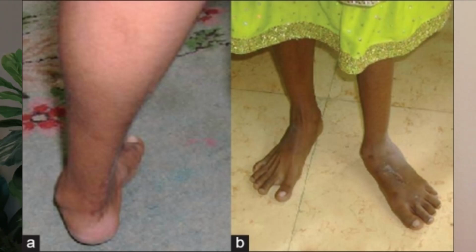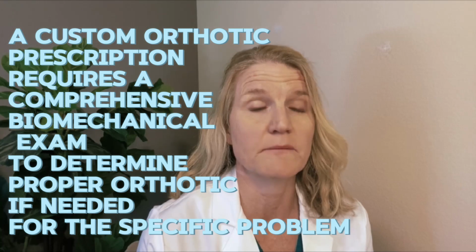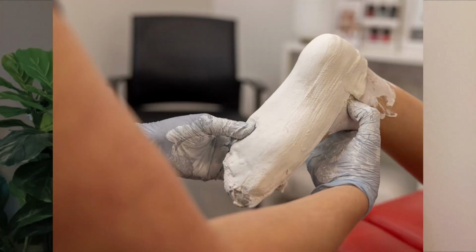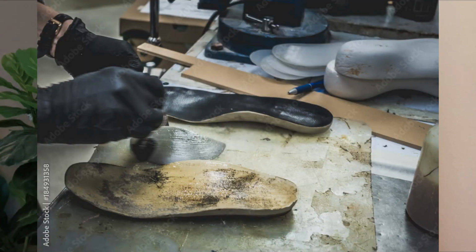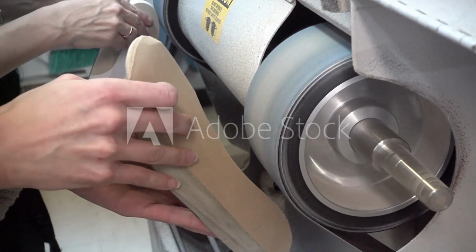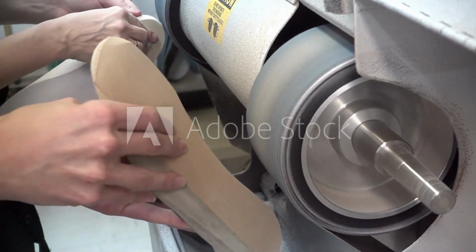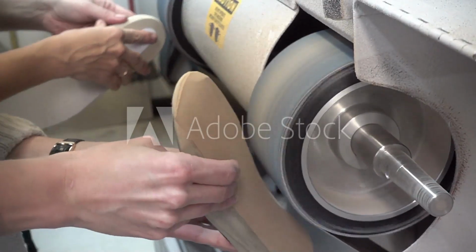So a prescription for custom orthotics requires a knowledgeable podiatrist to assess the abnormal mechanics and foot type that results in the specific problems. A cast or impression digitally is taken of the foot in a neutral position. So that's captured, and the detailed orthotic prescription is written, and the orthotic lab constructs the device. Because of the tedious work that it takes and the length of time to create the orthotic and the customization, they are very high cost, high value though, $300 to $500.